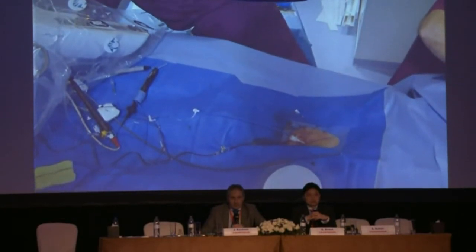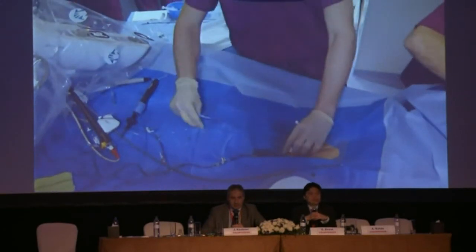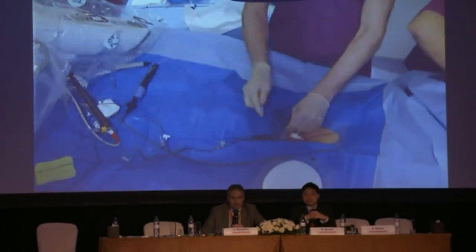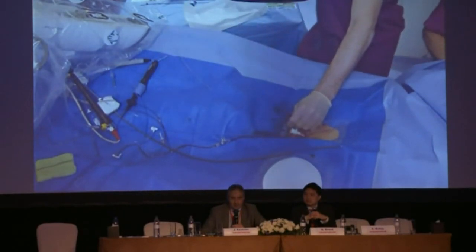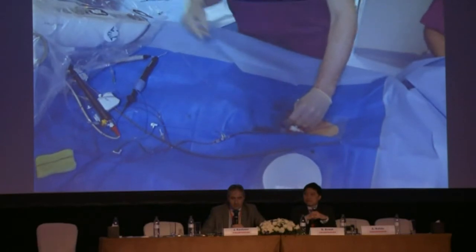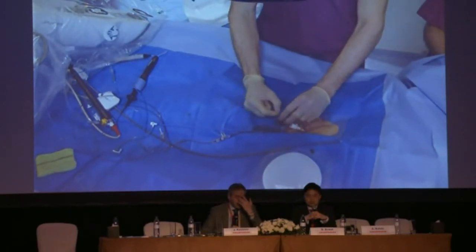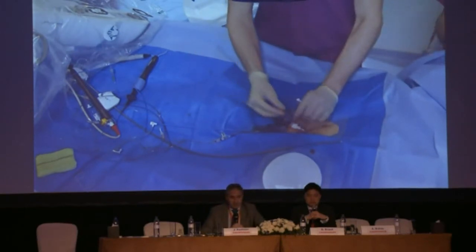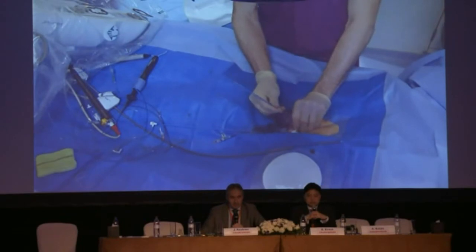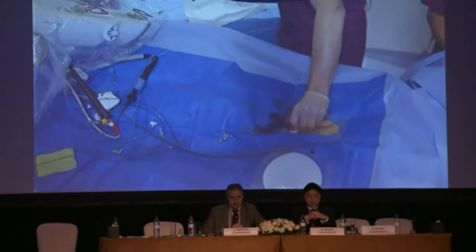And I would generally just try and characterize the areas that were really fast and ablate them as I go along. So I'd look for those type 1 electrograms that are really almost continuous and fast, and pick those off in every area of the atrium that I could find. I try and avoid the anterior wall wherever possible, or at least avoid doing a lot of ablation on the anterior wall, simply because I know that's the most contractile part, and I don't want to get rid of all their atrial transport.